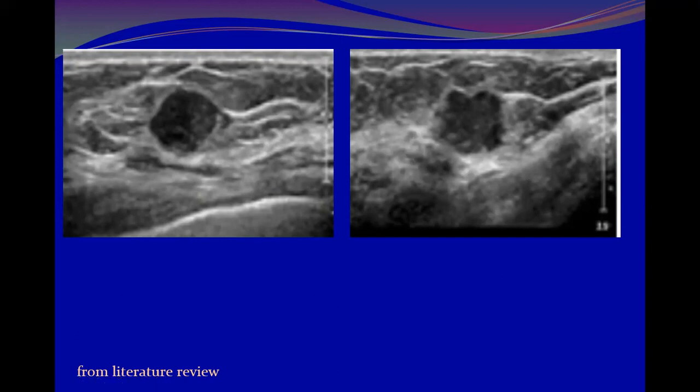Same machine, same settings, but different skills. I mentioned that the major disadvantage of ultrasound is operator dependence. You see? So this one is by a less expert operator than this one.